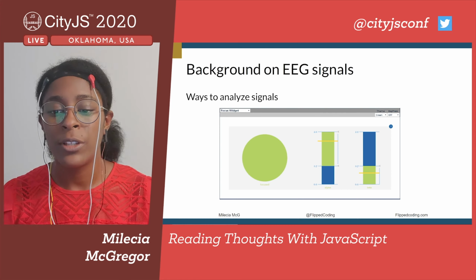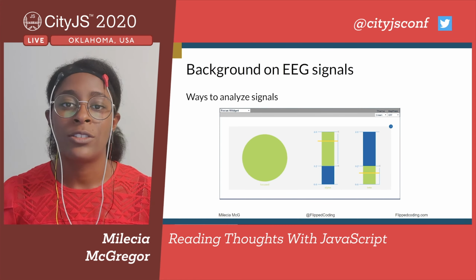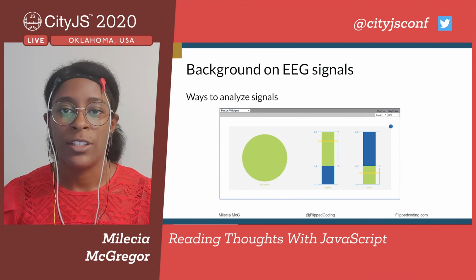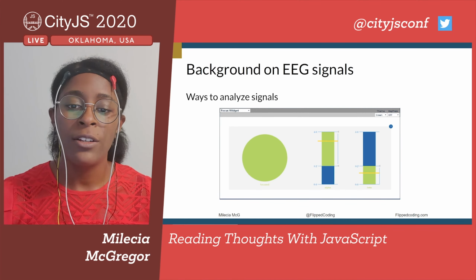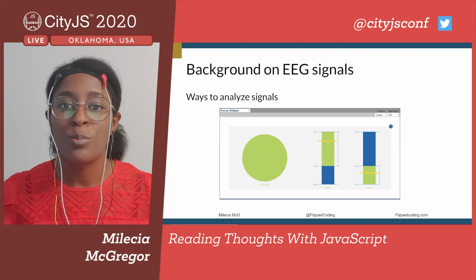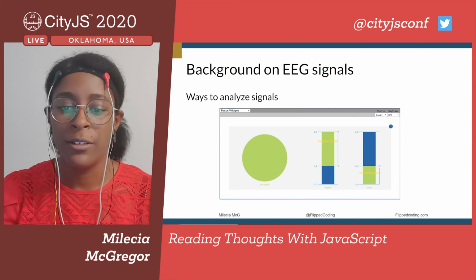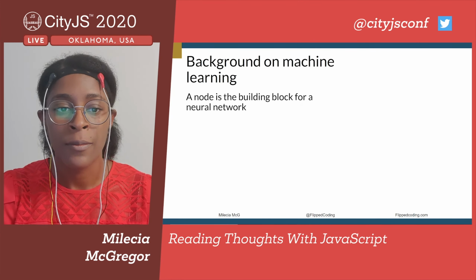We all know that beta waves are associated with active thoughts, so that problem solving, that decision making activity happens in the beta frequency. So when your beta waves are low and your alpha waves are high, that typically means you're pretty focused on something. I don't know what it was, but apparently I focused for more than 2 seconds.